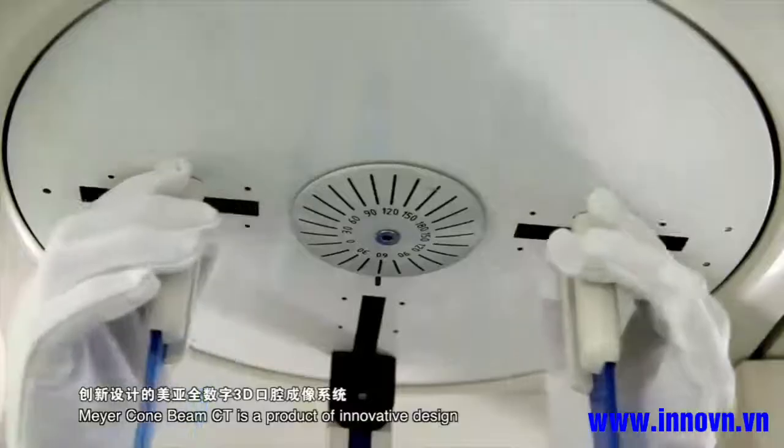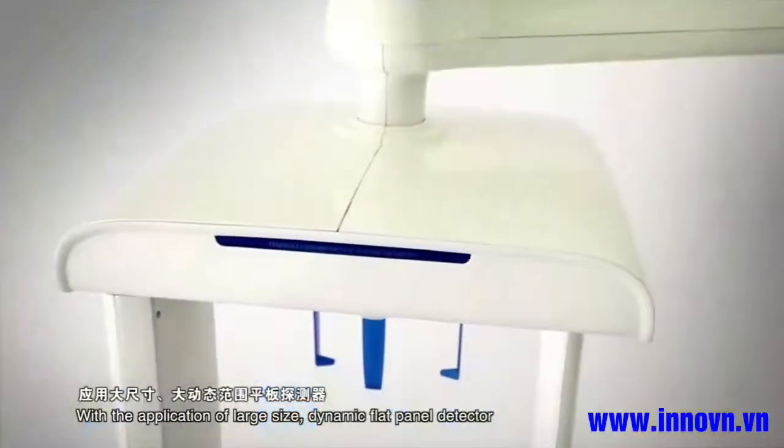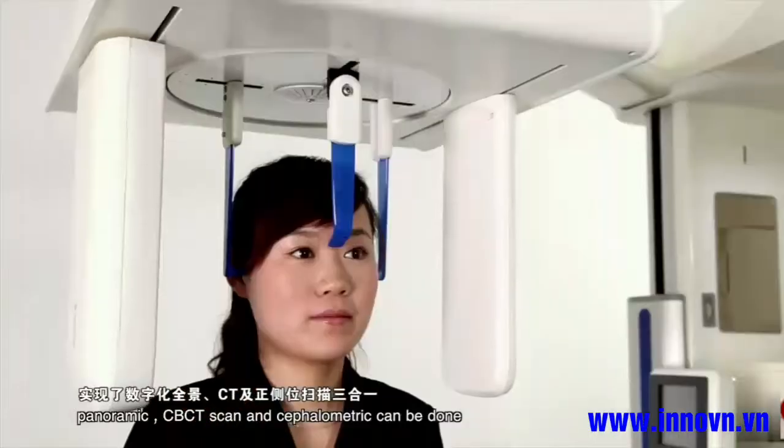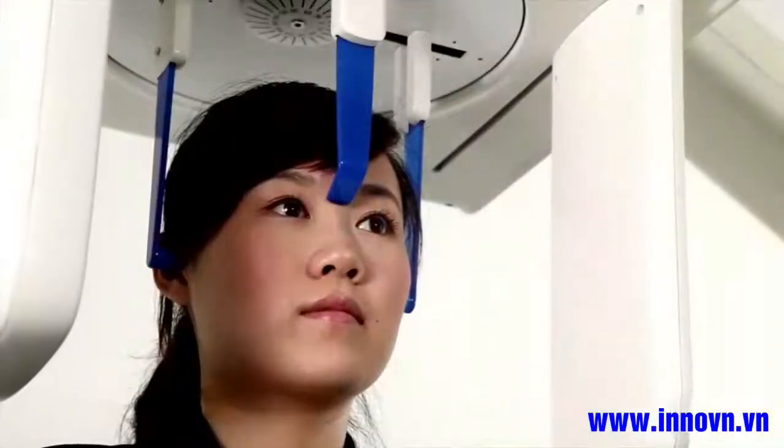Meyer Cone Beam CT is a product of innovative design with the application of a large-size dynamic flat panel detector. Panoramic, CBCT scan and cephalometric imaging can be done in this efficient 3-in-1 system.